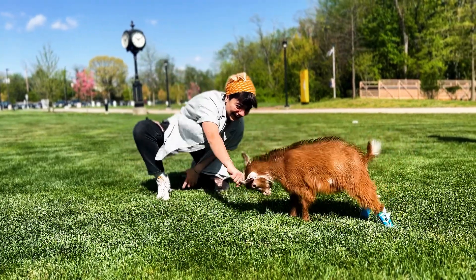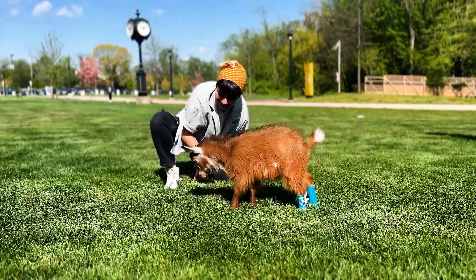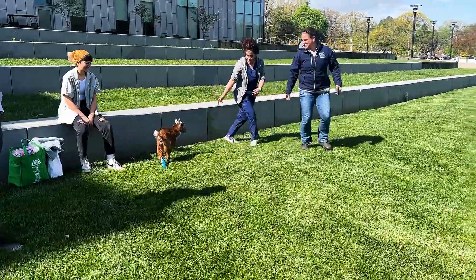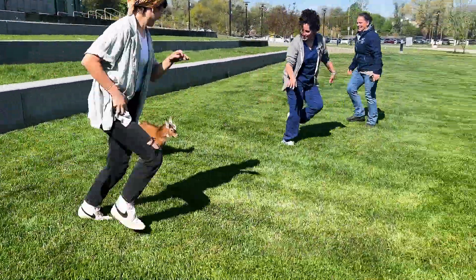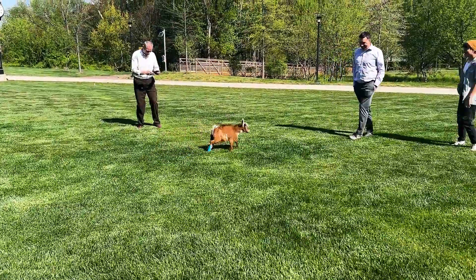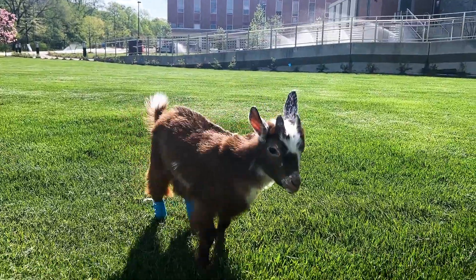After we got it on him and he did a couple laps around the studio — and pooped a couple times — we decided it might be best to move outside to really play-test it, since he hadn't been outside much. We all ran away from him; he looked at us, and after a couple seconds ran towards us doing a little hop. It was an amazing sight to actually see that he could run.